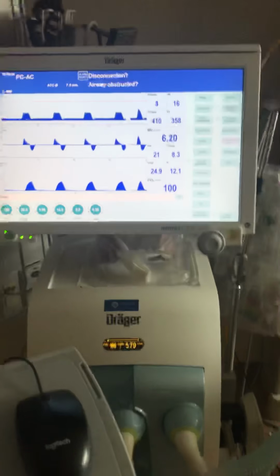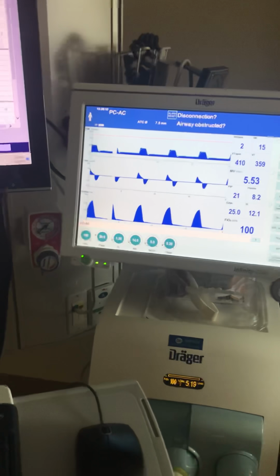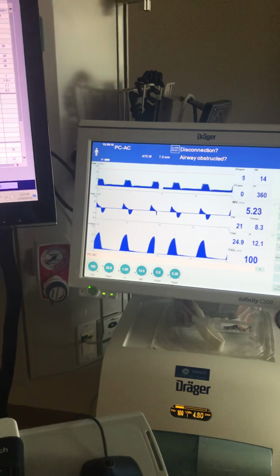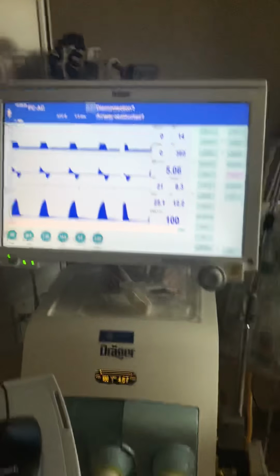So we have a patient that was admitted for pneumonia, currently in respiratory distress at 30 to 40 breaths per minute. The physician is intubating him. He's 5 feet 4 inches tall. He has a 120 pack-year smoking history, COPD, and CHF.